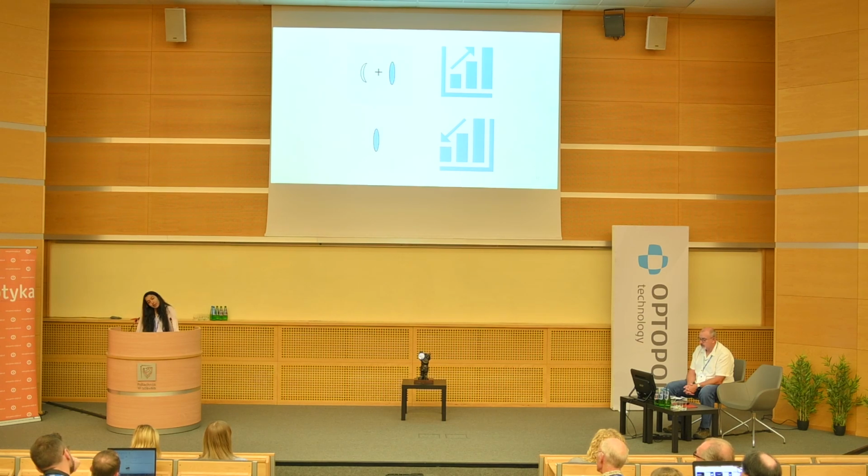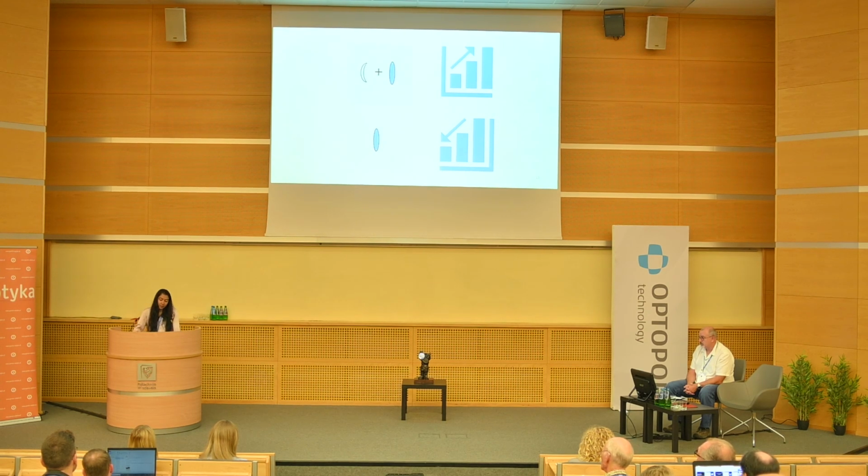So whether the IOL power really matters or not, it's not the case that it doesn't matter, because contact lenses are not permanent, so there would still be cases where the patient would not be using a contact lens, and they should still be able to have decent vision, because of which finding the right IOL power is important. But it's good to take into account that at the end of the day, the keratoconic eye might still need a contact lens correction on top of it.